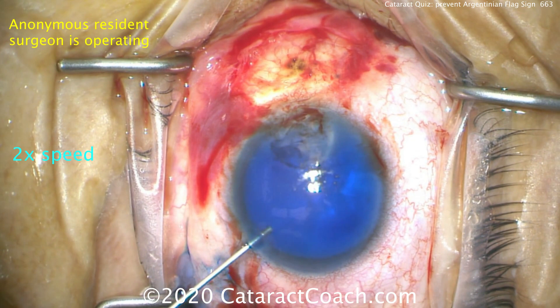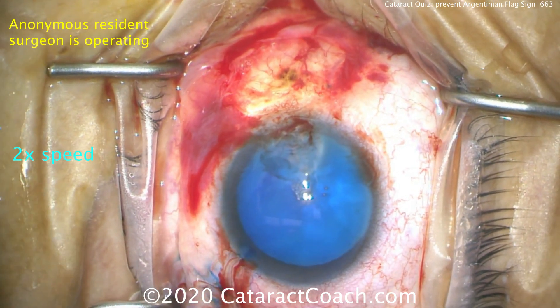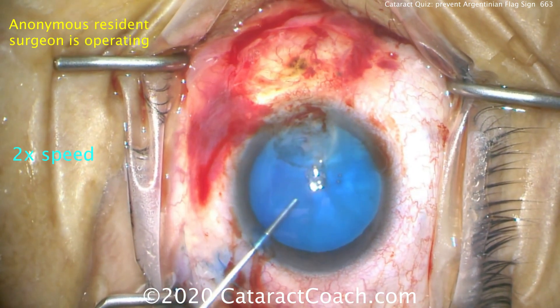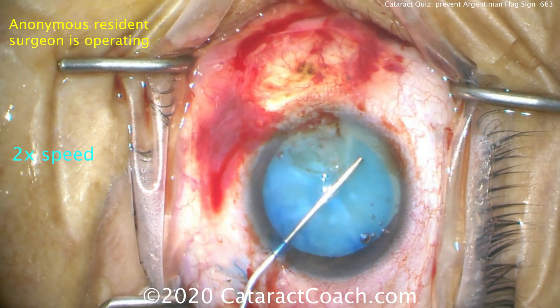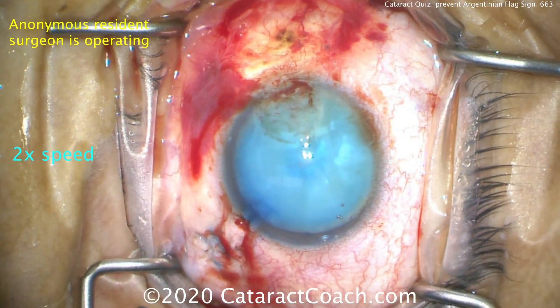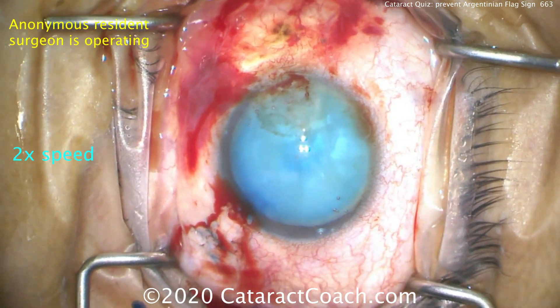So Trypan Blue Dye — we can dilute that down. Now I have a nice staining of the anterior lens capsule. Let's fill the anterior chamber with our viscoelastic, getting a nice high pressure in the anterior chamber. We want to have a high pressure so that we don't have that run-out of the rhexis.